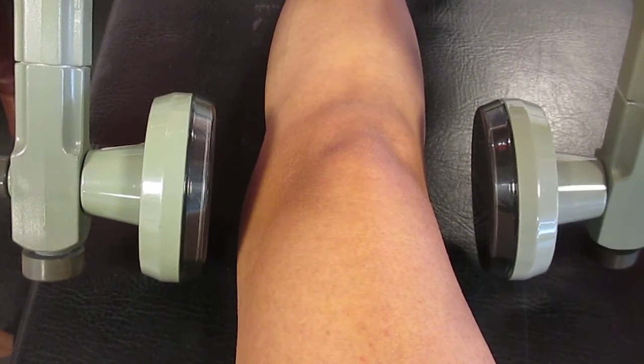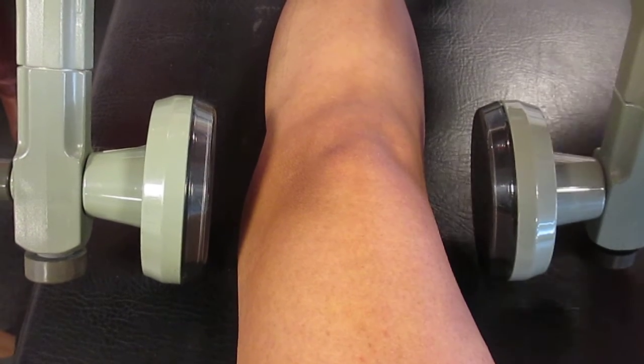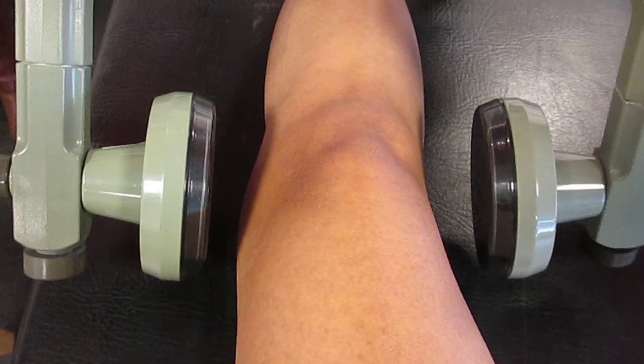Treatment times can vary. Treatment for an acute lesion would probably be nearer 10 minutes, whereas a treatment for a chronic lesion could be anything up to 20 minutes.